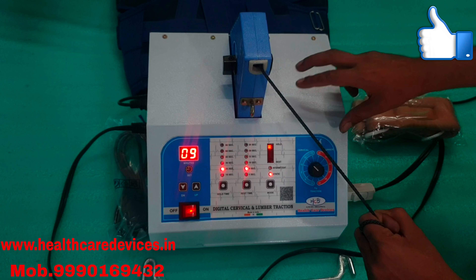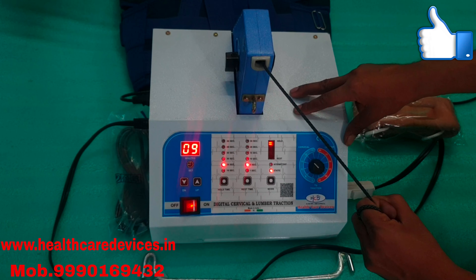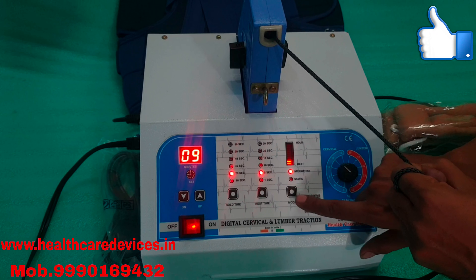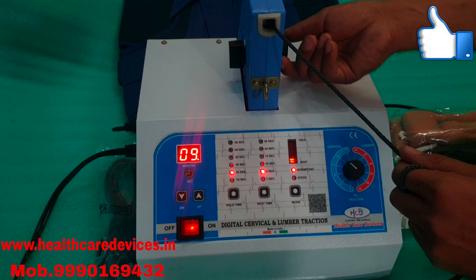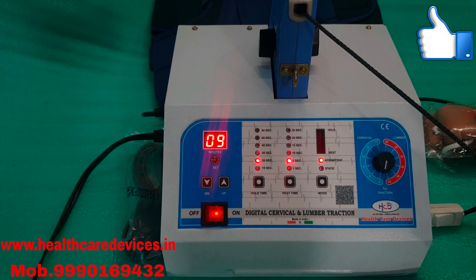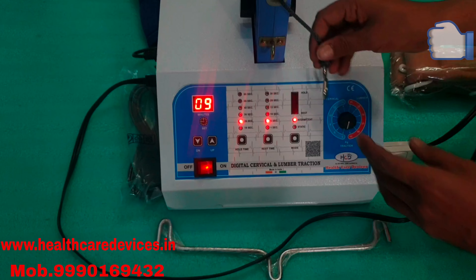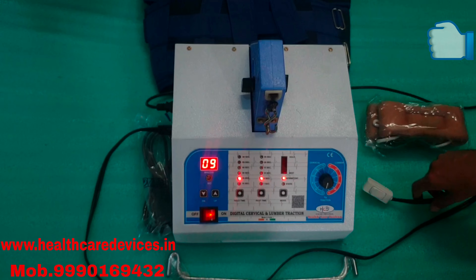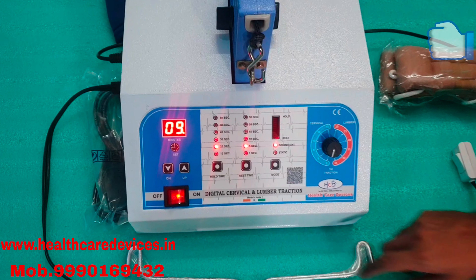This is the machine's small demo. This is the demo. Thank you.